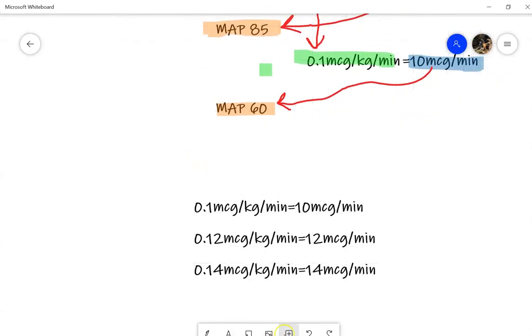So when we're titrating up on our epinephrine drip, let's say that for purposes of our little scenario here, and again, these numbers are probably too simplistic for how easy it is to titrate these drips, a dose of 14 mics per minute was going to equal that MAP pressure of 65 that we wanted.